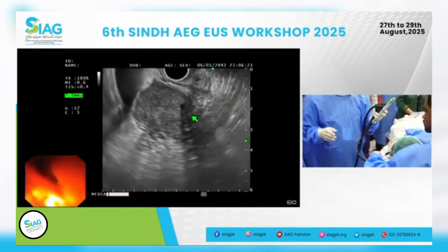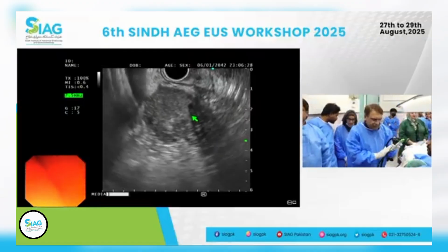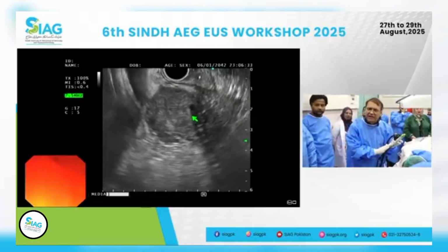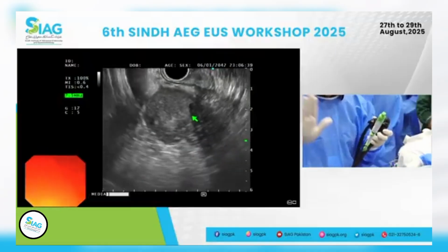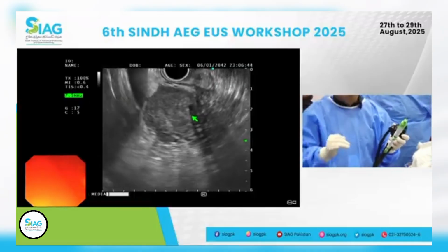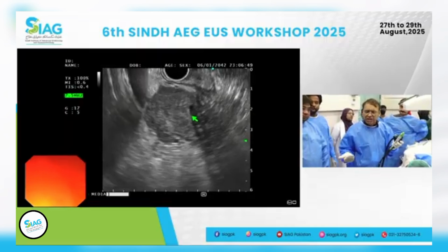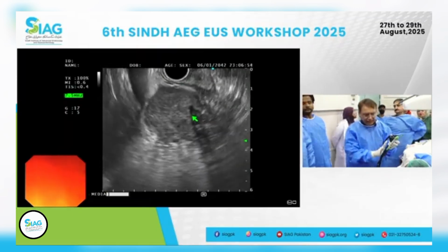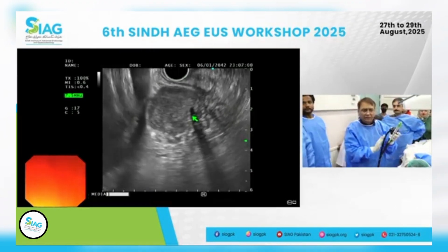Okay. So needle, that's an FNA, FNB separate talk. This is an Acquire needle, 22 gauge FNB needle. There's a Cook needle, there's an Olympus needle, all those needles out there. Whatever you have access to, use that and make it work. It will work eventually. You just need to find out a way how it's going to work. Some needles are a little bit better in certain regards, but this is an FNB needle. Should work really well. I put the needle onto the scope.